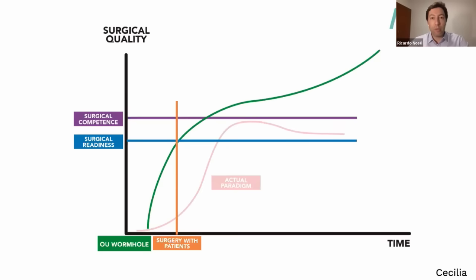Another thing that I think is very important for an effective surgeon in cataract surgery is to start learning backward. Start from the last steps of the phaco surgery. Start hydrating the incisions and then aspirating viscoelastics. And then every time you're adding a step, you can work up to doing the phaco from the beginning to the end.